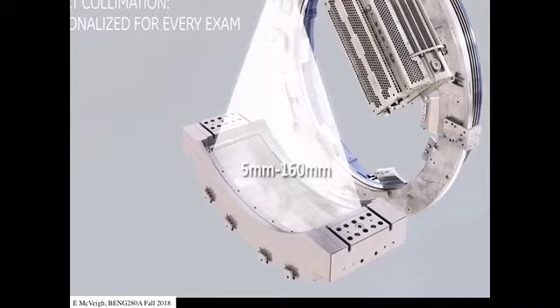This thing also is a very interesting design strategy of General Electric. Everybody takes their own path on this one. But what they've done is they've made an X-ray voltage generator here that can flicker between two energies. So it can go 70, 140, 70, 140, 70, 140 at a few kilohertz. And so this beam is sort of flickering between two energies, so you can take an image at one energy and an image at the other energy simultaneously, which is pretty cool. And we might look at why you'd want to do that.